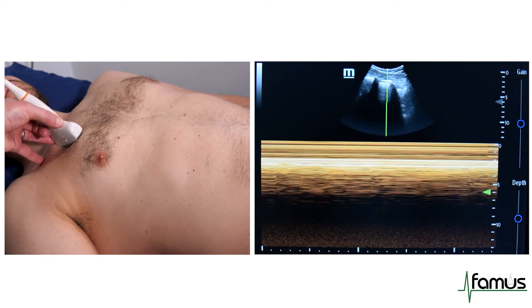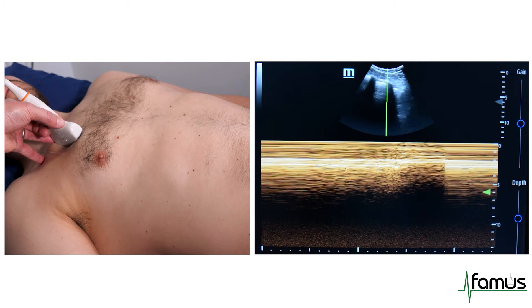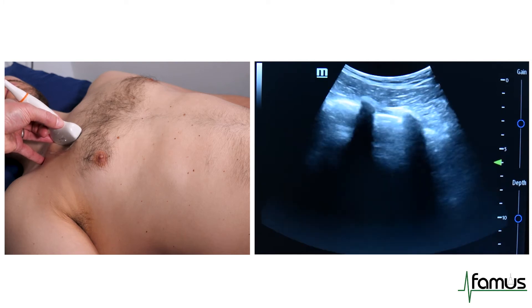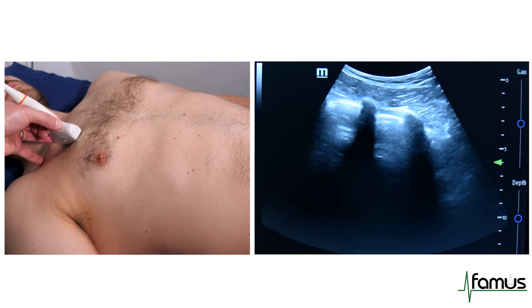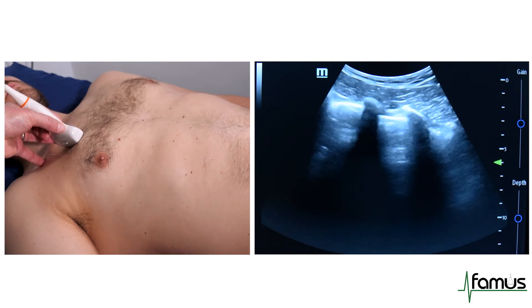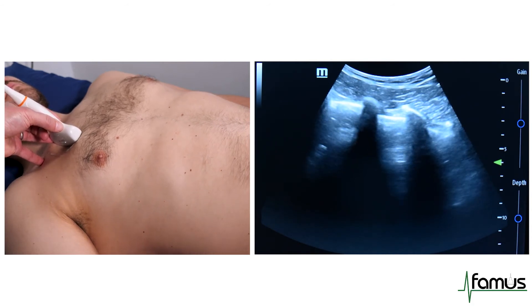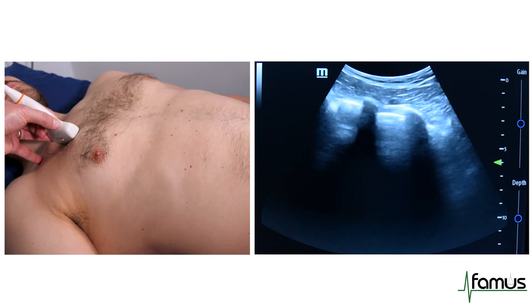As we return to B-mode imaging, we assess for lung sliding, the presence of A lines, and also look for the presence of B lines — of which we don't have any B lines here.